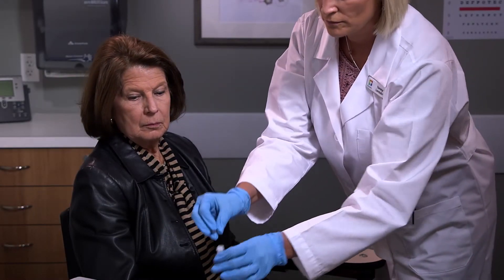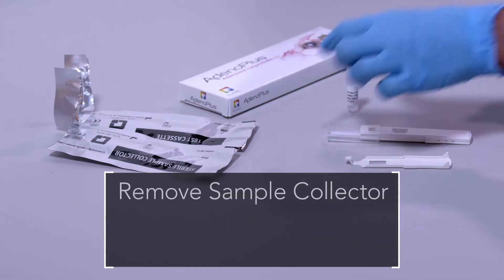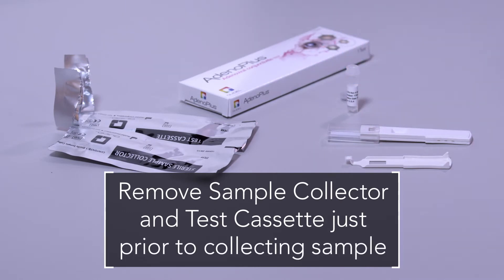Remove the lid from the buffer vial. Remove the sample collector and test cassette just prior to collecting the sample.